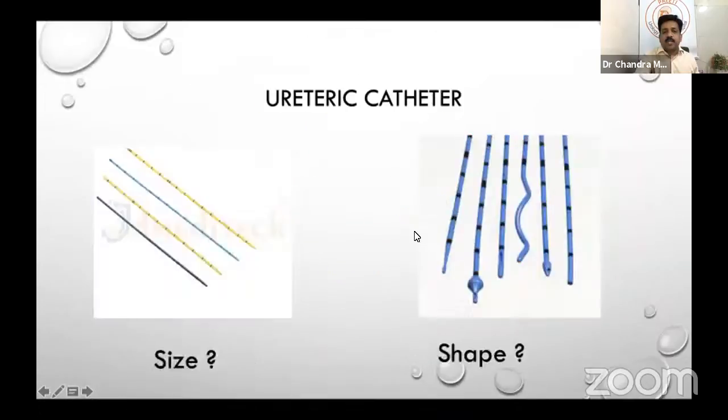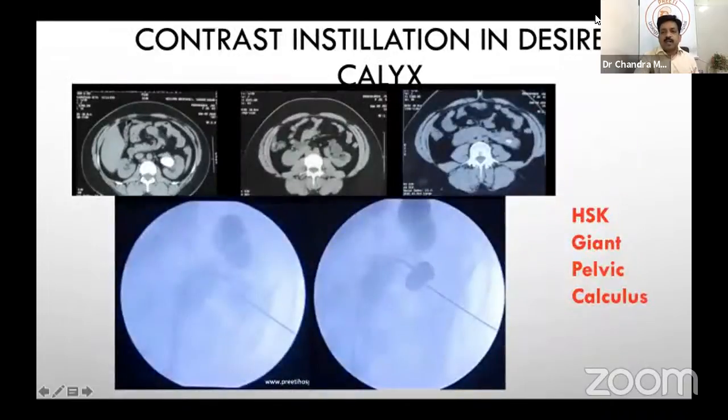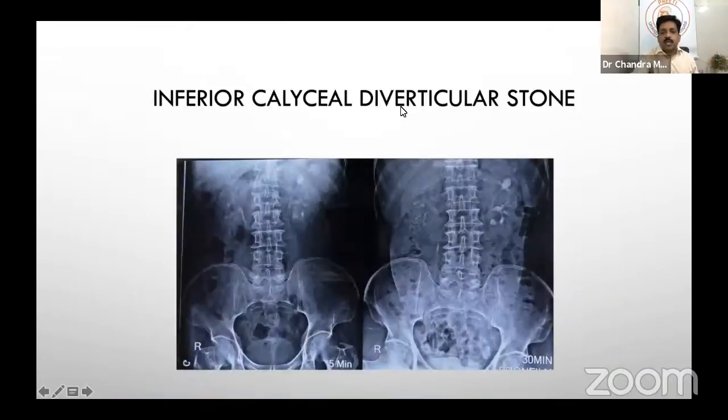Sir, now I will share all the nephroscopes available in India. After that, I will ask the question. I kept three scopes from Wolf and Olympus in India. After that, we will see which scope you will choose. Most of you are using maybe one or two scopes, but just quickly, because a lot of juniors were asking, we will share the scopes quickly. Scopes only.